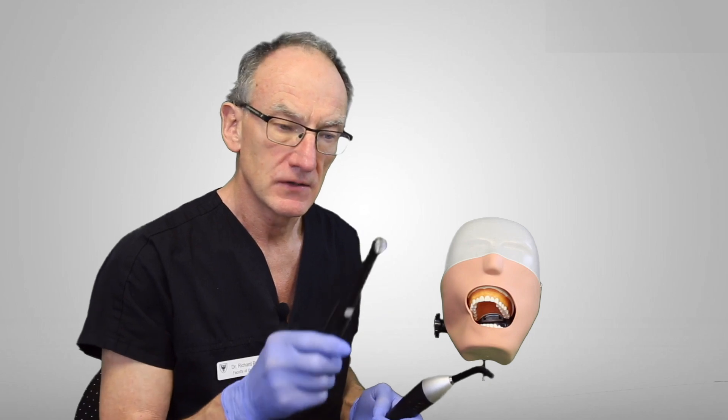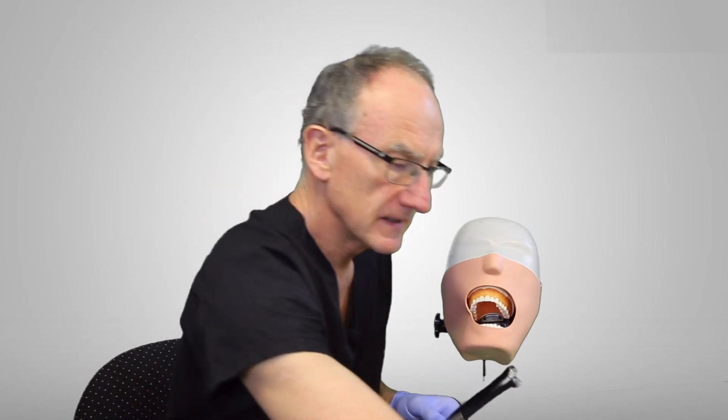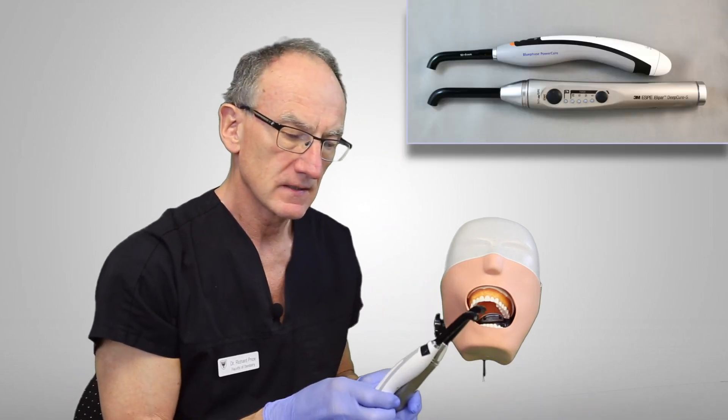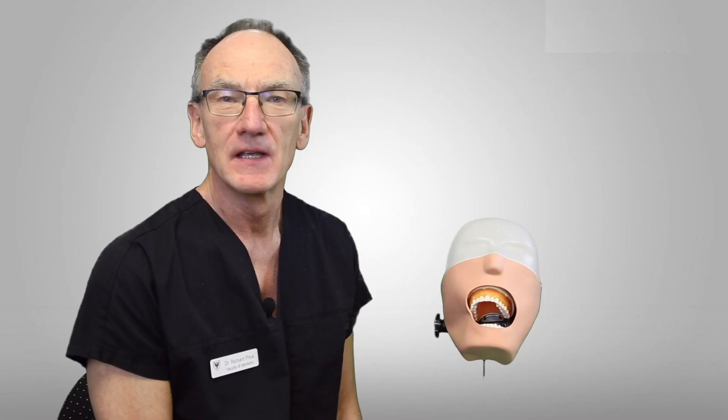Thank you very much for watching this video. I think you've seen that the ergonomics of curing lights is really important when you're making a decision about which light to buy. My recommendation is to buy a light that's got a low profile head such as this, rather than a light such as this. Examples of low profile heads would be these lights here. These are good, or if you're going to buy one with a light guide, then lights such as this and this are good — they give you good access to the posterior teeth. Stay tuned for more tips and tricks on light curing.